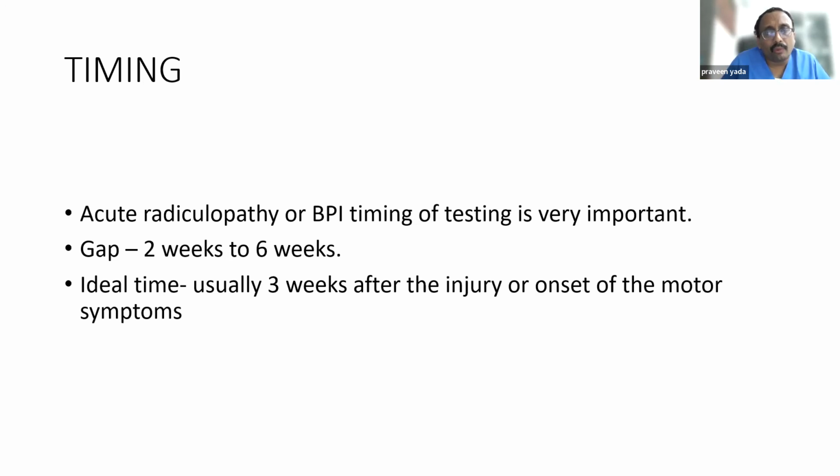Then during the viva, they can have a trace of the recording, or they can show it on the video. In the trace, obviously you can't hear the audio. Therefore, the waveforms become very important. Whereas if there is audio, we will try to find out what it is. Normally they will ask for a fib or fascic, or a neurogenic activity or a myogenic activity. These are the normal things they will ask during the exam.